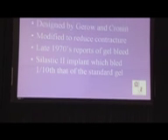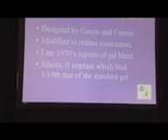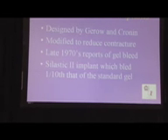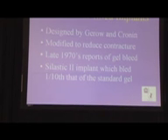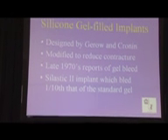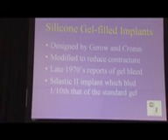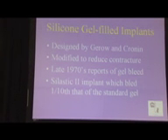However, when it leaks, it's an intracapsular leak. It's more of a bleed that stays inside the capsule, which is a collection of collagen tissues that is produced by the body to wall off this foreign object. So if it does bleed, most of the time it stays in there. And if it does leak outside there, it has been proven that it doesn't cause any of the diseases, the cancer, the autoimmune diseases that they thought it did.